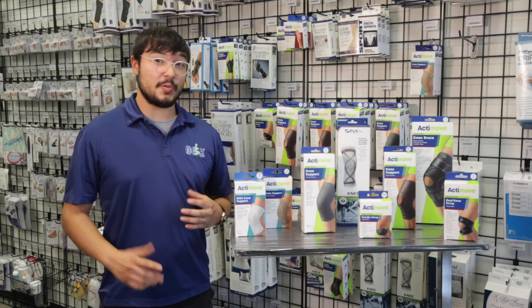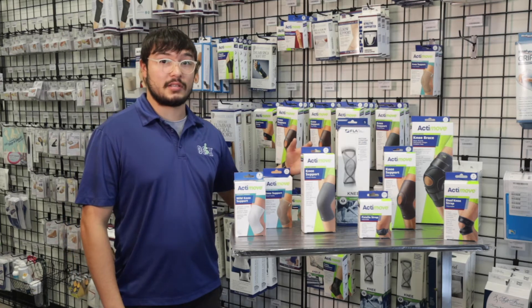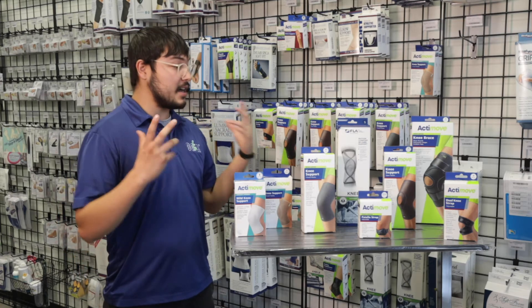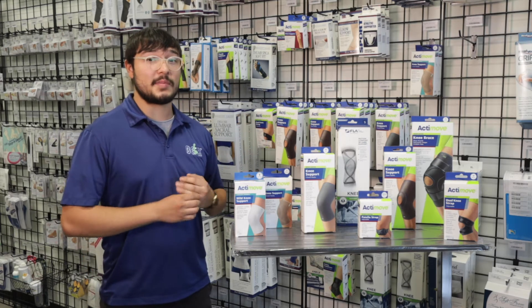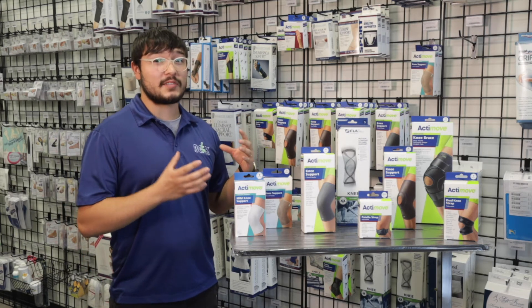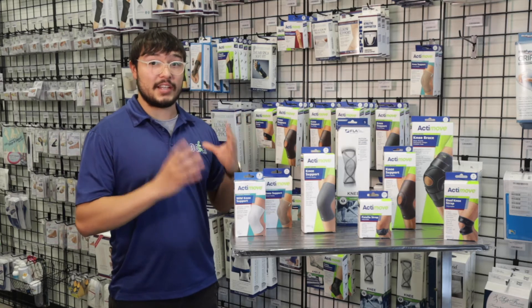Now let me show you about our knee supports. We have a ton of different kinds of knee supports here at B.E.K. — some that are mild and some that are for severe injuries.